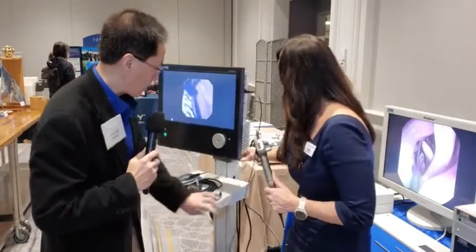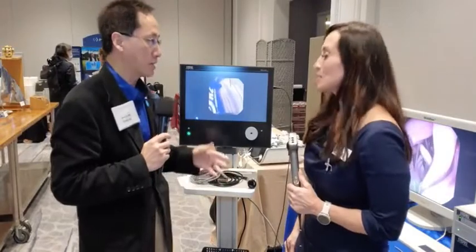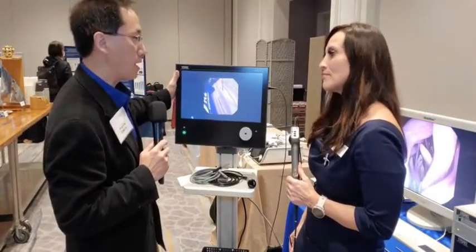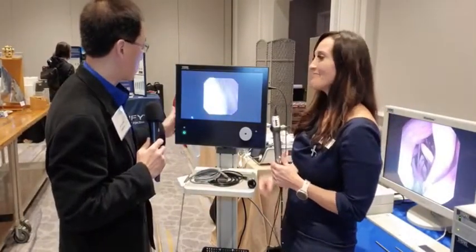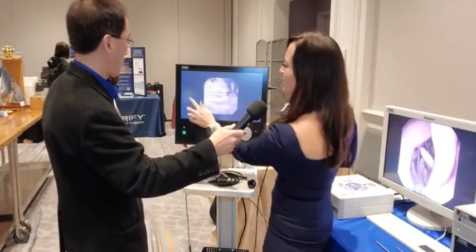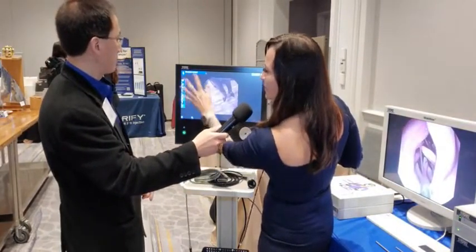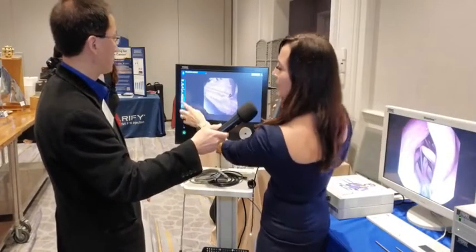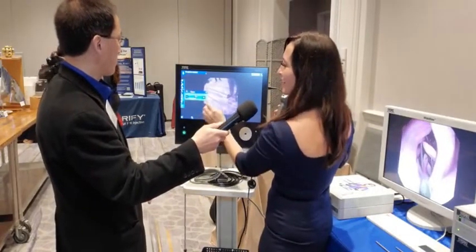That sounds great. This is a cart with a pretty small footprint, so it's good for a small office with a small exam room or procedure room. It's got a DVI output so you can connect to a different monitor if you wish. And it has a touch screen — just like your iPhone. Technology keeps advancing. You've got image capture, you can change light intensity, flip your image, zoom in and out — all touch screen.